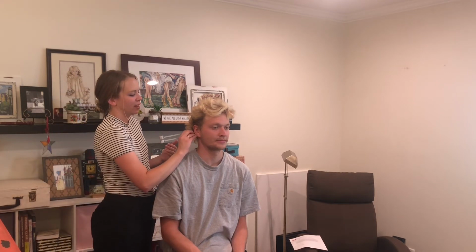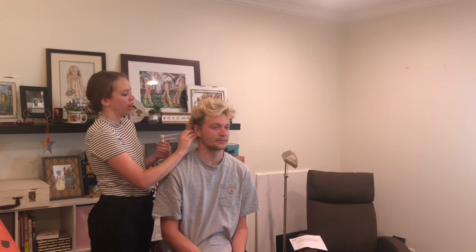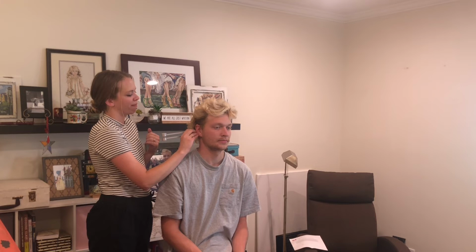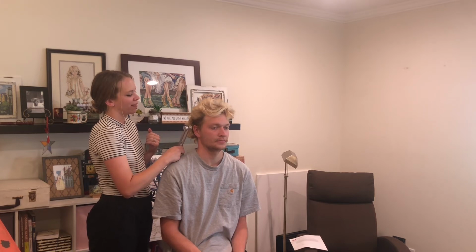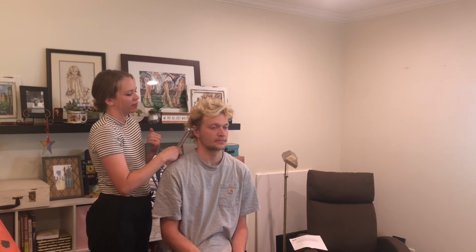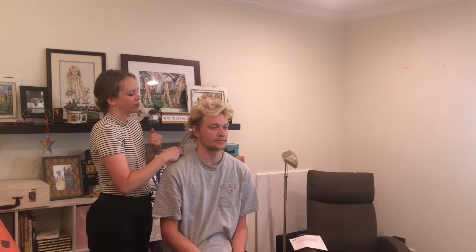And same thing on this side. The bone conduction should, or the air conduction should be twice as long as the bone conduction. Perfect. And his were about twice as long on the air conduction.